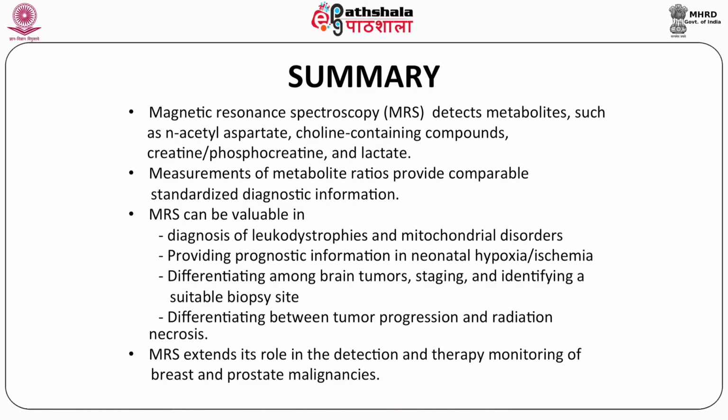Let us summarize. Magnetic resonance spectroscopy or MRS detects metabolites such as N-acetyl aspartate, choline containing compounds, creatine, phosphocreatine and lactate. Measurements of metabolites, measurements of metabolic ratios provide comparable standardized diagnostic information.